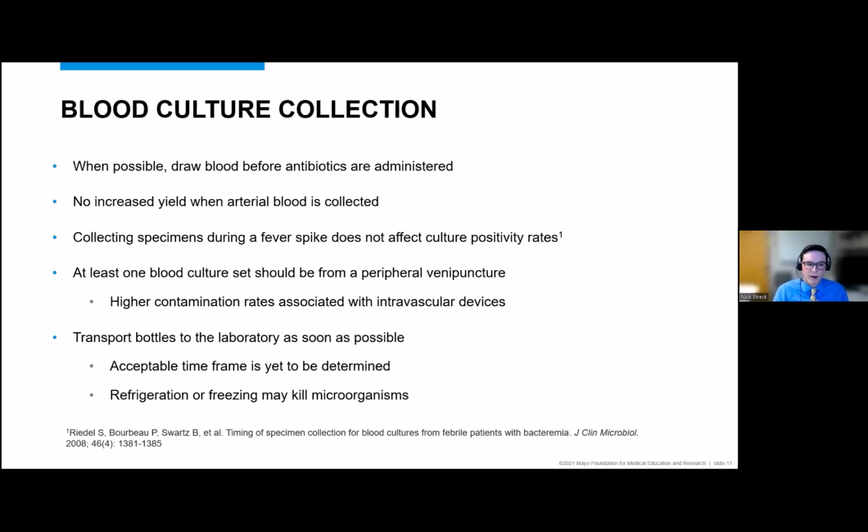That really hasn't been borne out in studies that have looked at blood culture performance. So really more importantly than trying to time collection around fever spikes, the important recommendation that we give is we want to get these collected as soon as possible, and we really want to focus on getting the appropriate volume collected promptly rather than trying to time that around a fever spike, because that doesn't really seem to affect positivity rates.